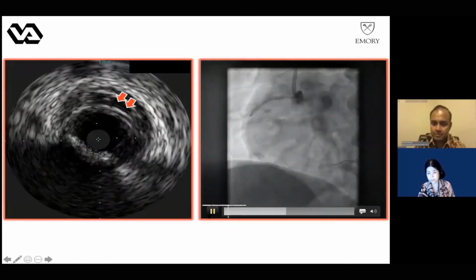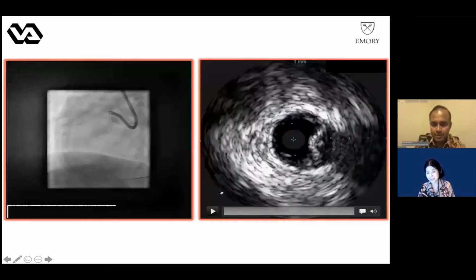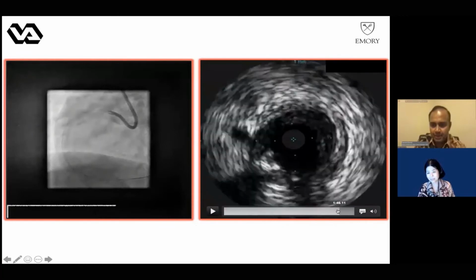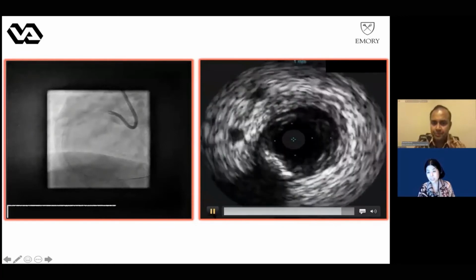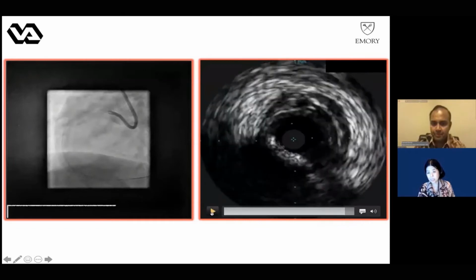And then go more. And here it is even more clear. You see the 3 o'clock, and then jumping proximal to the stent? Oh, I'm sorry. Let me see if I can get it back. Okay, here you go. So this is exactly the edge of the stent. And now you see, let's say start, yeah, that's the place. You see again the dark area.